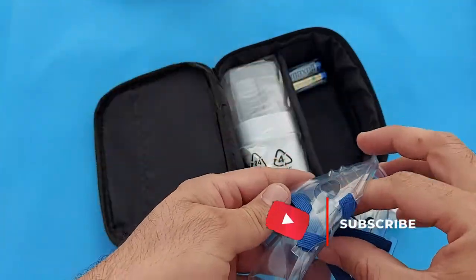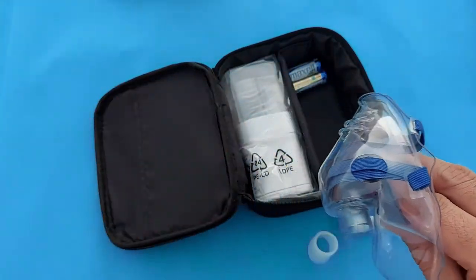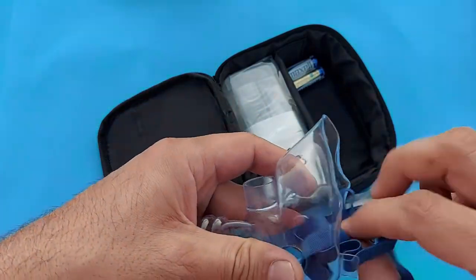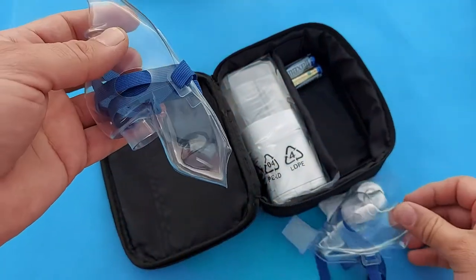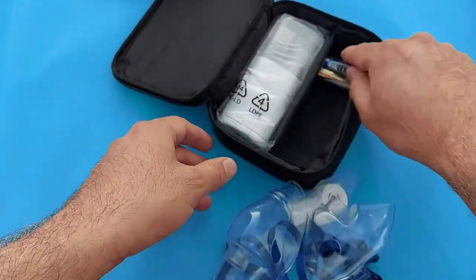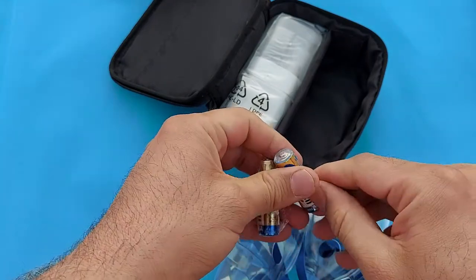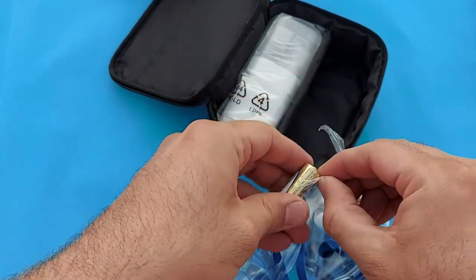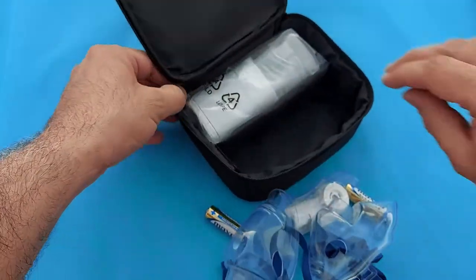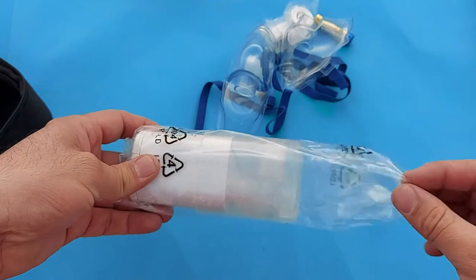Let me show you here in this video: this is the mouthpiece, this is the pediatric mask — you will use it for kids' nebulization — and this is the adult mask, which you will use for adult patients. These are the batteries which we will install in the device to operate it, with no electricity and no need for any rechargeable device or electrical charger.